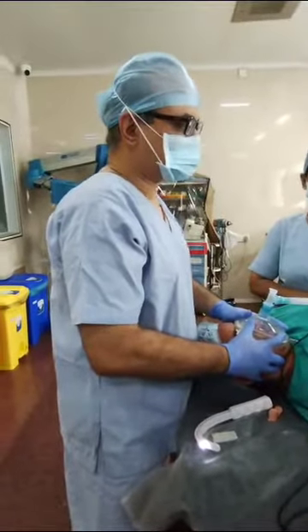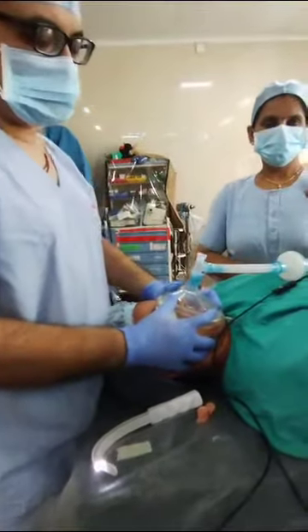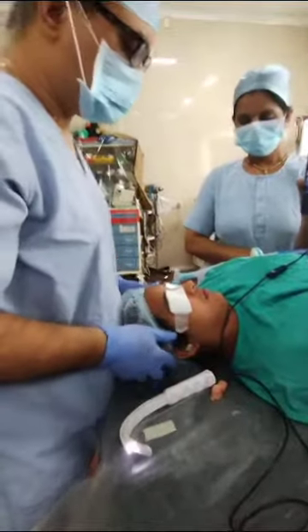Female, 27 years, post-aortoplasty, simple intubation. We are doing this with TASCOPE, just to demonstrate the use of TASCOPE.